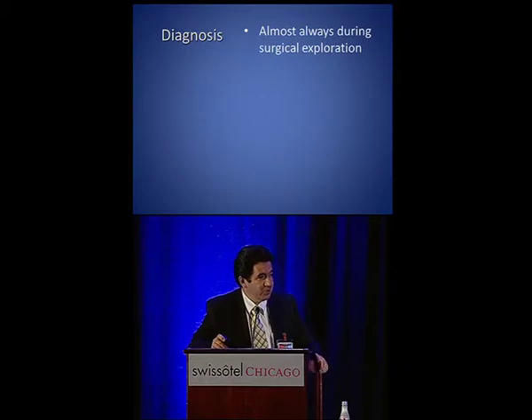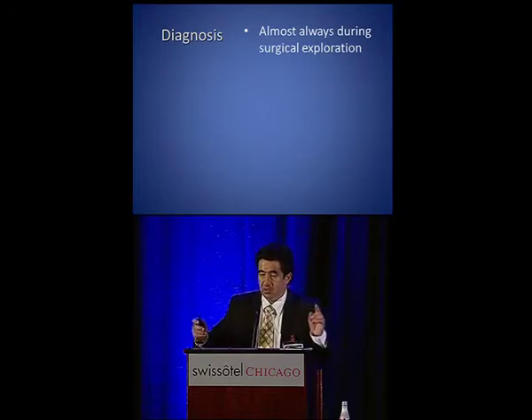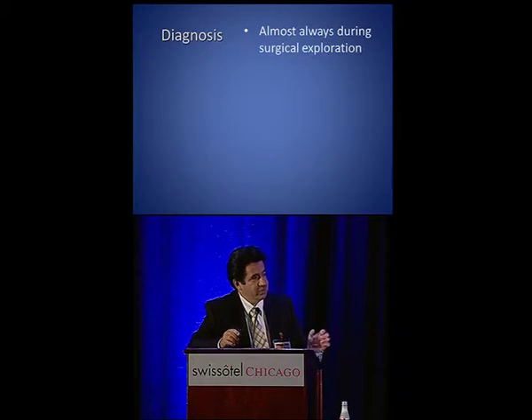In reality, you have seen it when you are doing balloon angioplasties in veins and you create a perforation, or when you're pulling IVC filters out, and sometimes you need to yank a little hard and you pull it out and you do a venogram and you see some extravasation of contrast. And 99% of the time the bleeding is contained because the low pressure in the veins equilibrates with the pressure around it. The problem is when you have an open space. Retroperitoneal hematomas, usually if you don't touch them, they don't get worse. I think the main take-home message for venous trauma is that as a surgeon, you can make it a lot worse than it was.